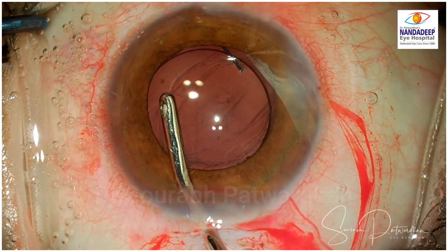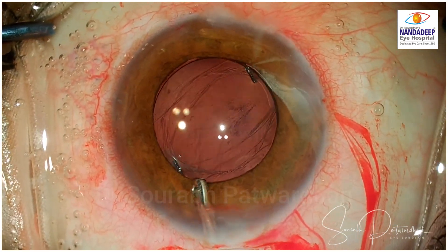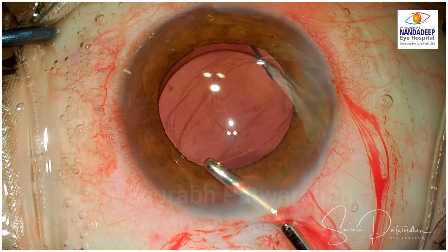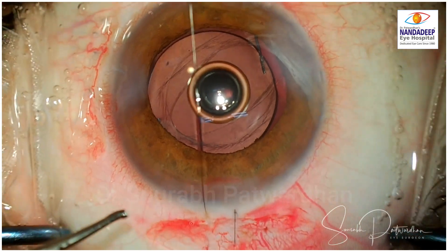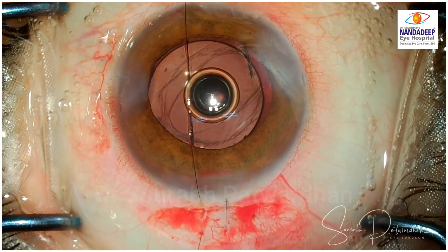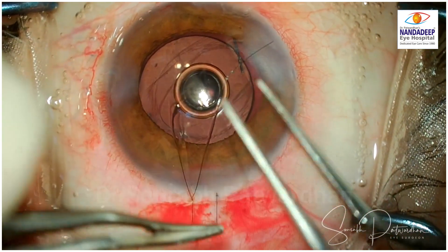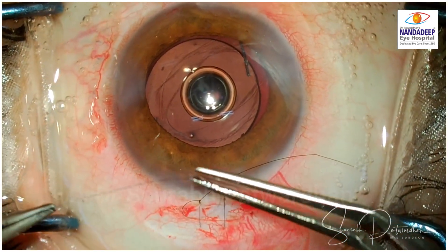I have done biometry using the optical biometer ILMASTER 700. For sulcus placement I generally reduce the IOL power by 5% — so if it was a 20 diopter emmetropic IOL power, I will put 19 diopters in the sulcus. The wound is sutured with not-too-tight sutures just to avoid any gap, as this is a partially vitrectomized eye and we don't want any AC collapse in the post-operative period. The sutures are buried into the sclera and the wound is closed.